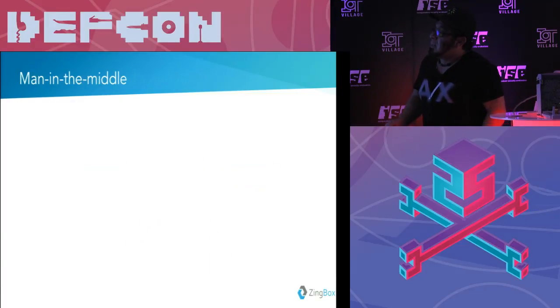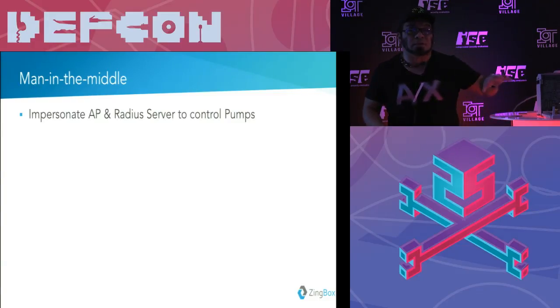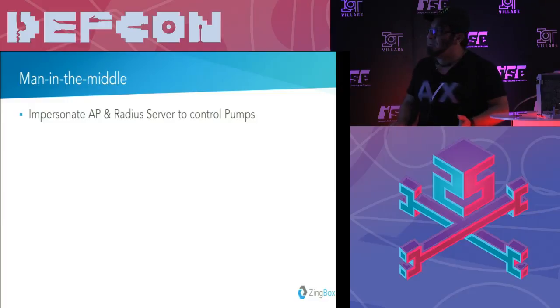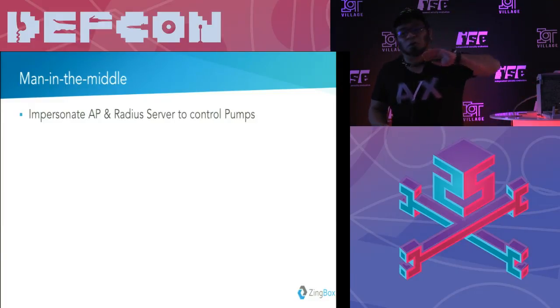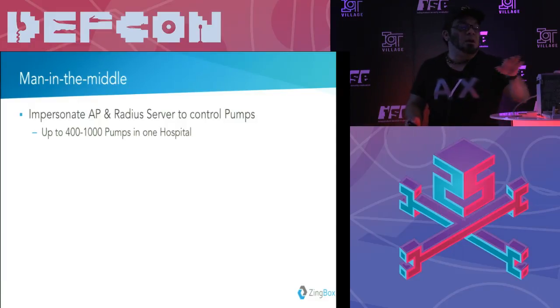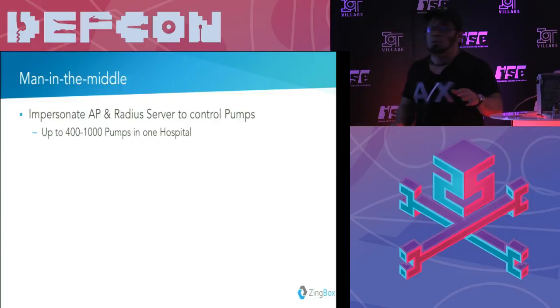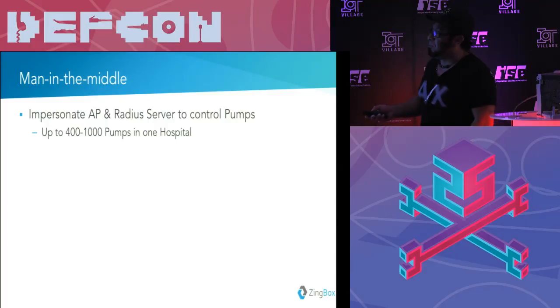The second thing is man in the middle, which means we can impersonate the access point. Since we know the configuration file and we find a way to override the internal RAM memory, sorry, we can reconfigure this guy and say, hey, don't forget about that, connect to me. As I said, there are from 400 to 1,000 of these devices in a network. So you can either man in the middle them, or you can ask them to talk to you so that you can start decrypting the information.